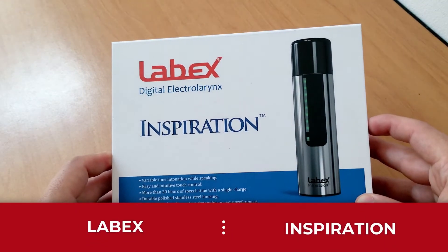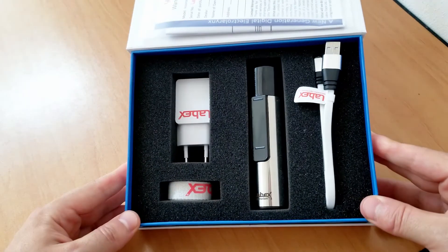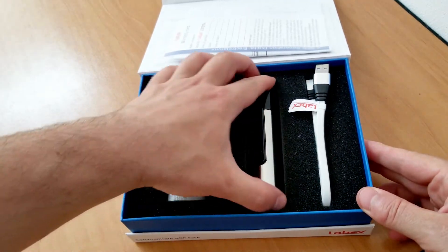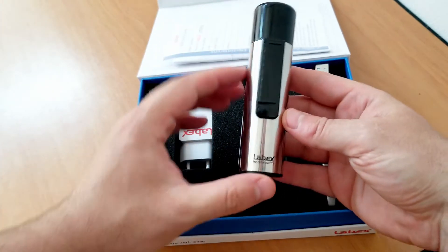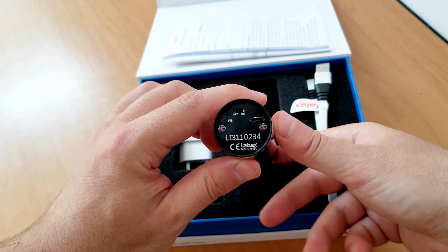Here is the LABEX Inspiration, the most advanced electro larynx on the market. The LABEX Inspiration gives you the opportunity to express emotions while speaking by changing the tone or volume of the sound.